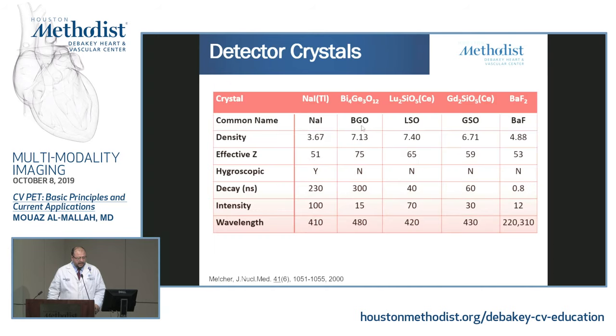Now, these are the detectors that we are using in PET. So sodium iodide, we mentioned, is for SPECT. For PET, you can either have a BGO, or the most commonly used nowadays is a lutetium-based, so LSO. So all you need to know is that these detectors are lutetium-based. There are factories where they grow them. So for example, our machine's detectors are usually grown in Tennessee. There's a factory, and they have to do a very delicate job, keeping it at a special regular temperature.